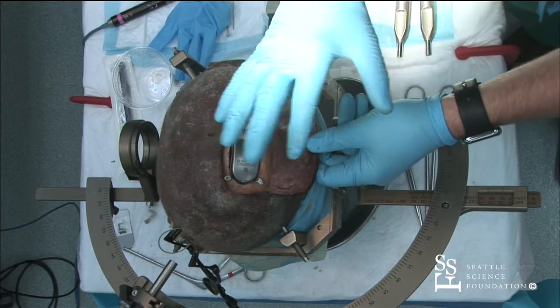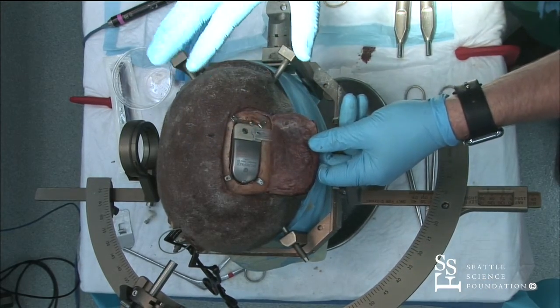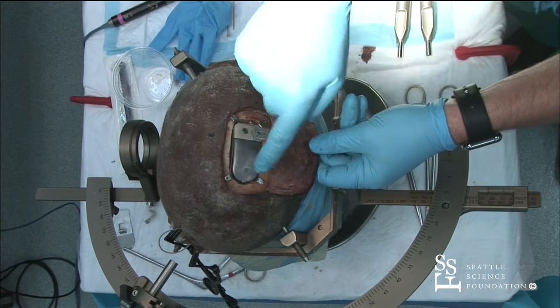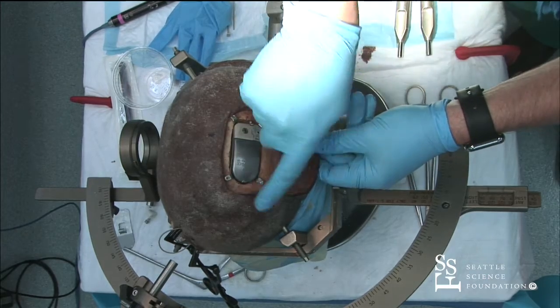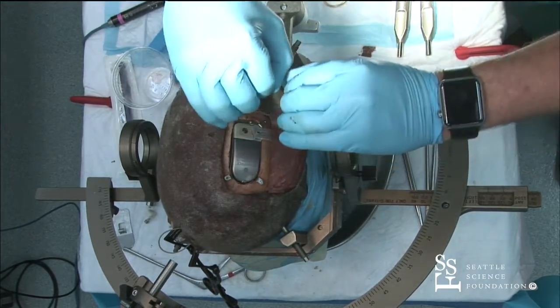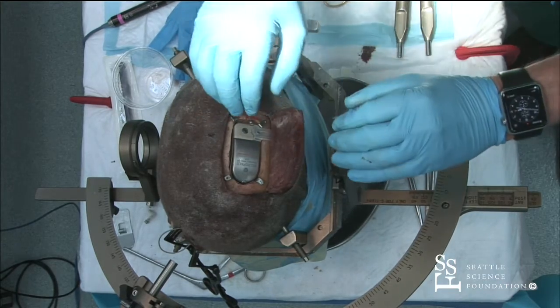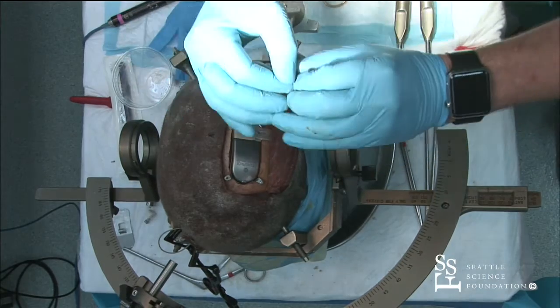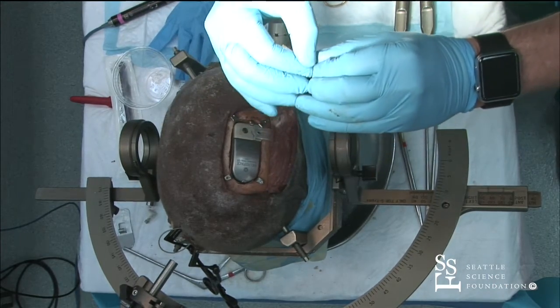Tons of irrigation with antibiotic solution, at least 3 big bulbs. And then I try to undermine as much as possible, particularly for redos when you're changing the battery. Oftentimes it's cemented right onto the skull, and if you don't undermine it, then you can't bring that galeal edge back together again and get a good deep closure.